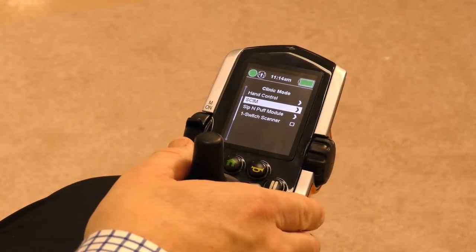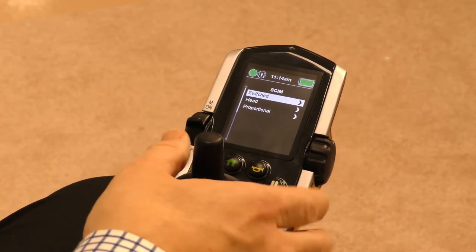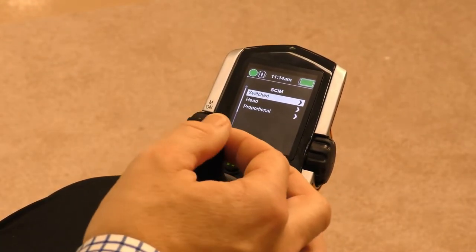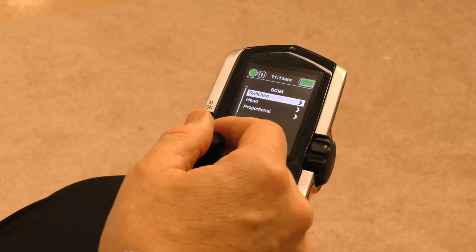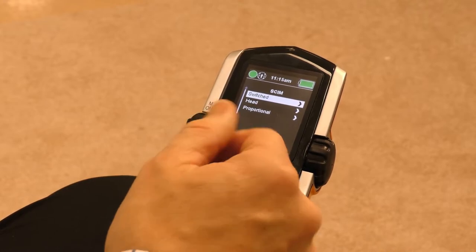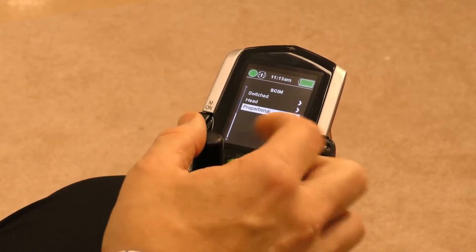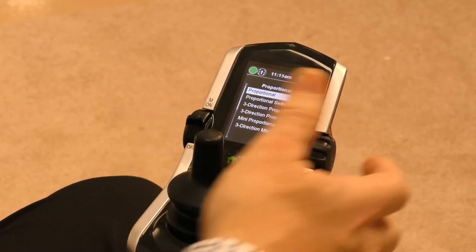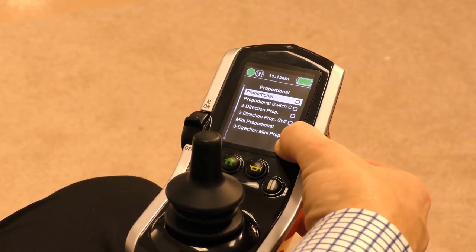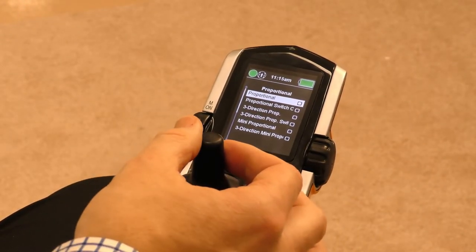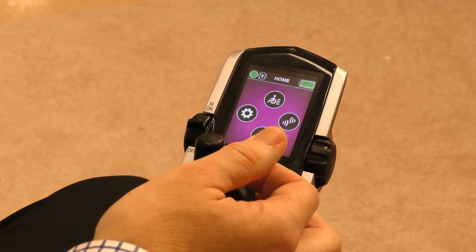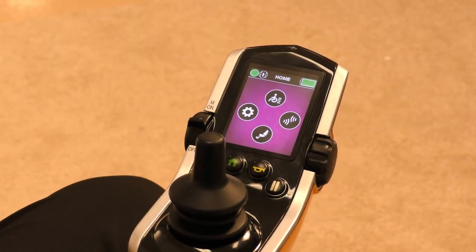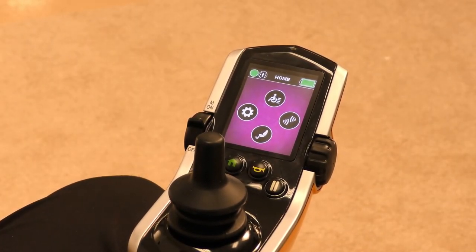We are going to use the skim module, make a right command, and choose how we're going to use that. Currently we have a proportional joystick plugged in, so we're going to go down to proportional, make a right command, and we have all of our proportional options here. We're just going to use standard proportional, make a right command, and that device is now in charge of the chair and we can utilize it for the evaluation process.